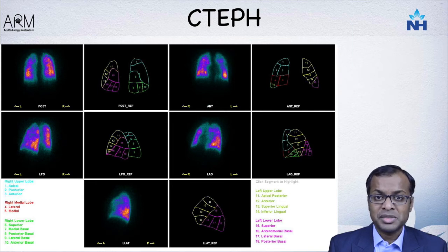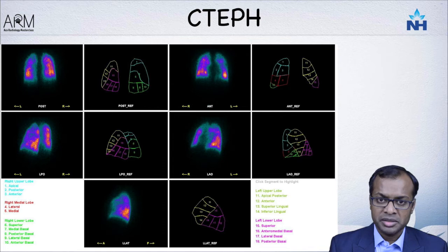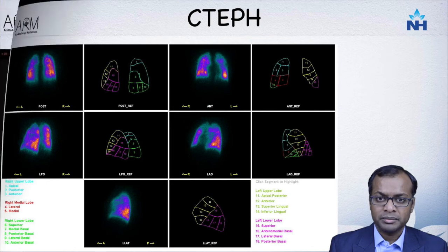Patients who have subsegmental pulmonary embolism often go undetected on CT, and a VQ scan is extremely helpful in demonstrating perfusion mismatch compared to ventilation in these patients. So another modality which helps us in assessing these patients better.